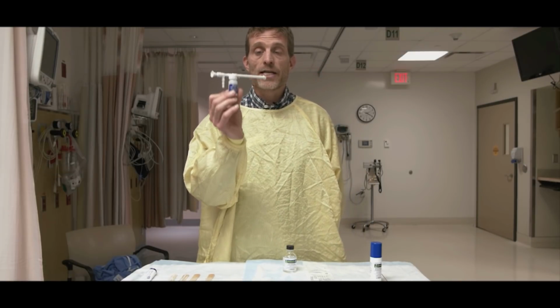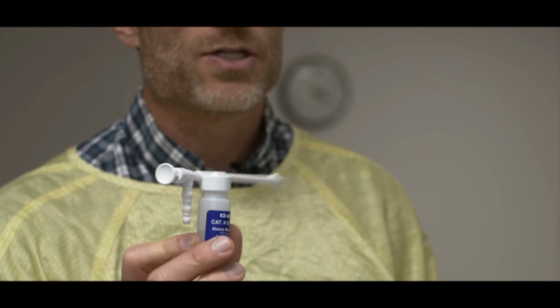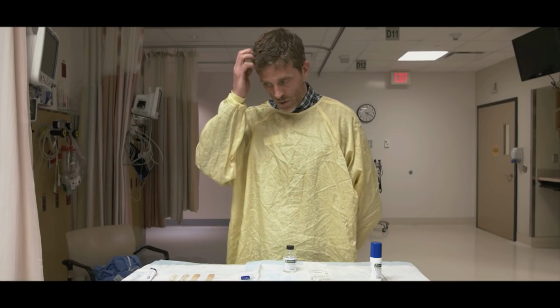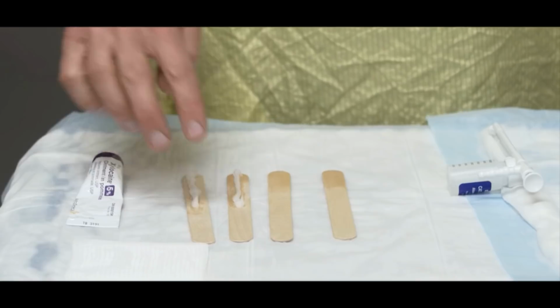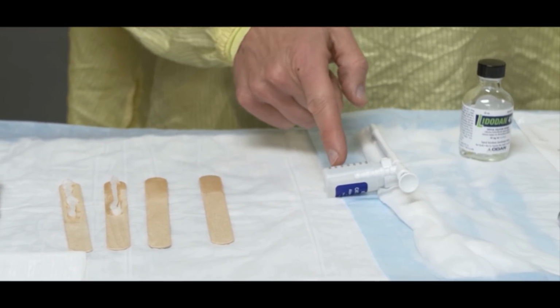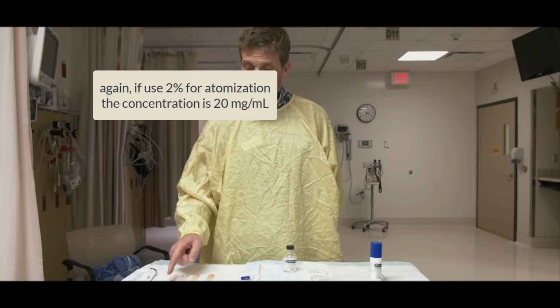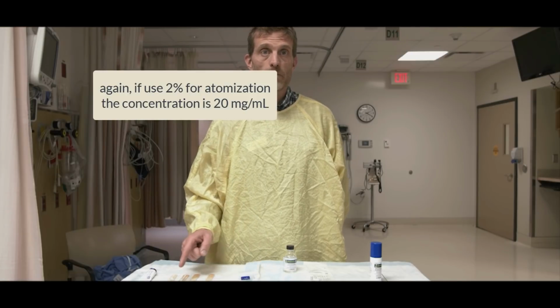He then had 10 cc's of 4% in the atomizer. That's 400 milligrams, but we only used 4 cc's. So we have 40 milligrams with the nebulizer that we're not going to use again. We have 160 milligrams here, and we have 4 cc's times 40 milligrams, 160 milligrams of lidocaine here. So we used 320 milligrams.